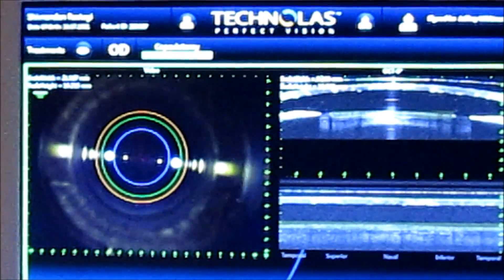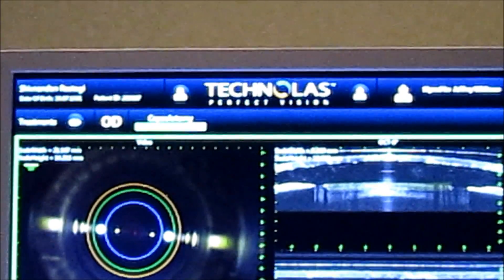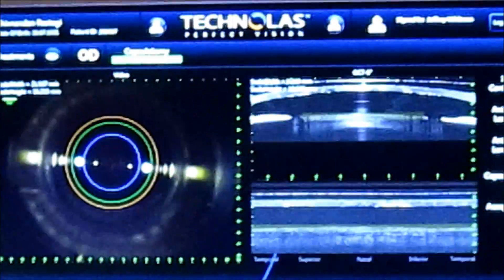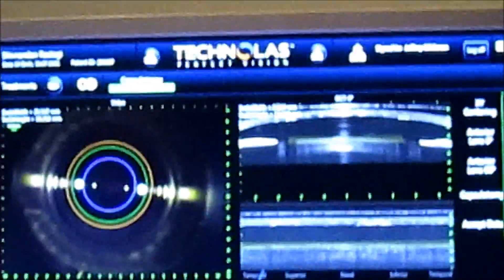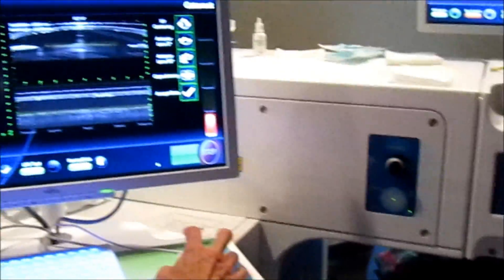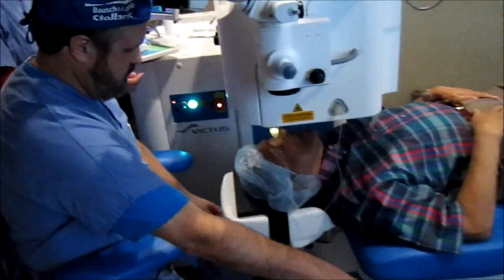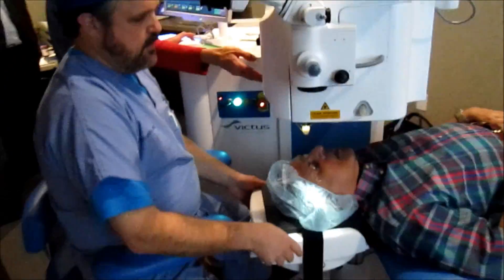You may hear that beeping in the background right now. We look for the execution bar to fully complete. Once that's done, the vacuum comes off automatically, so you don't need to unhook anything. You simply bring the table down, take the patient out, and the capsulotomy is complete.